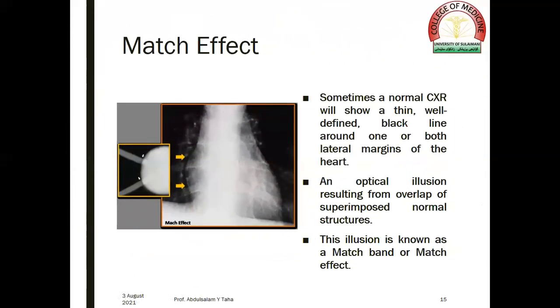A cardiothoracic ratio greater than 0.6 suggests cardiomegaly in a newborn. One of the cardiothoracic signs is called the Mach effect. Sometimes a normal chest x-ray will show a thin, well-defined black line around one or both lateral margins of the heart — an optical illusion resulting from overlap of superimposed normal structures. The illusion is known as a Mach band or Mach effect, like in this chest radiograph.